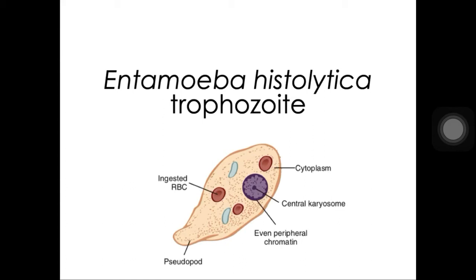Okay, so Entamoeba histolytica, basically amoebas, are your protozoans that may have a cyst and a trophozoite form. So what we presented here in the first three images is the trophozoite of Entamoeba histolytica. To describe it, it exhibits rapid, unidirectional, progressive movement achieved with the help of its finger-like hyaline pseudopods.